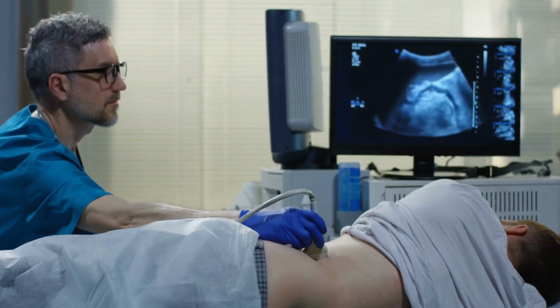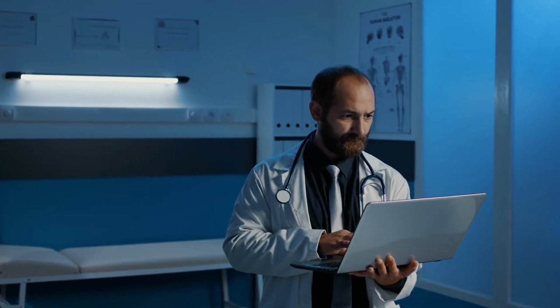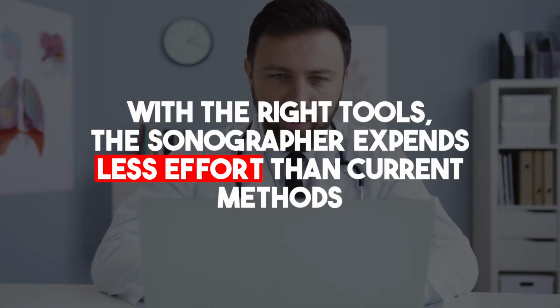In academic settings, residents or fellows often serve as the automation tool to help create draft reports. However, dedicated software has emerged to automate the creation of reports. I use the ultrasound modality as an example, but you can see where you could apply this to a number of other modalities. An opportunity in ultrasound exists because sonographers scan the patient and then fill out either worksheets or write a summary of some sort. With the right tools, taking relevant information from the sonographer, measurements and worksheets creates an opportunity to automate that and create that draft report. In that way, a sonographer provides the same level of automation as the resident or fellow, as previously mentioned. With the right tool, the sonographer can even expend less energy than they do today with current tools.